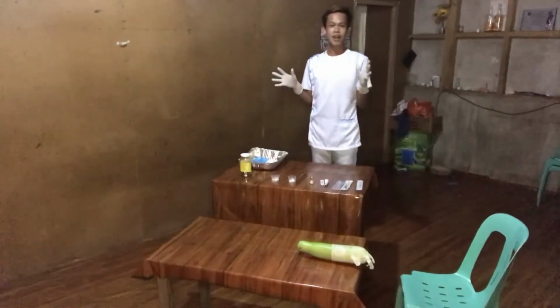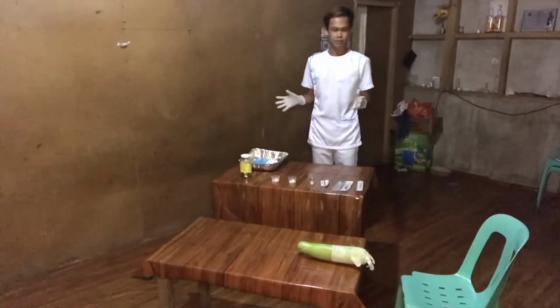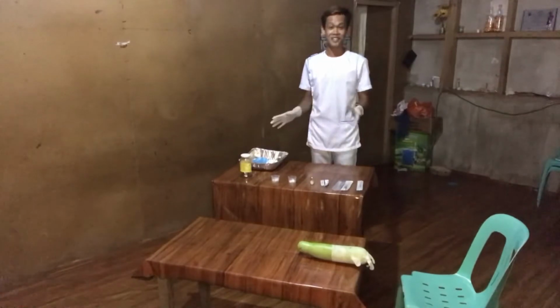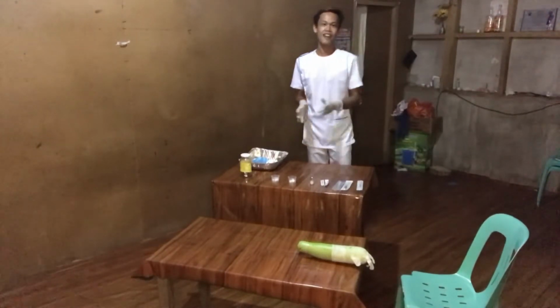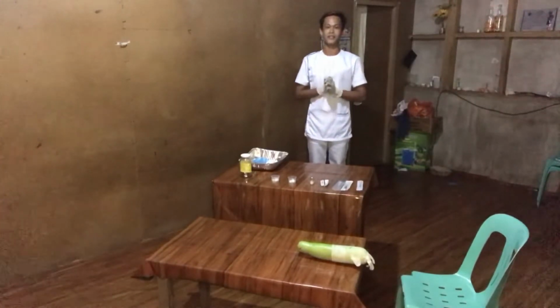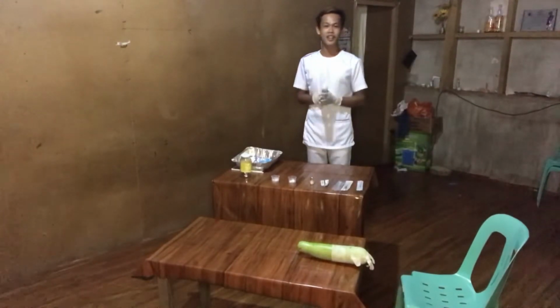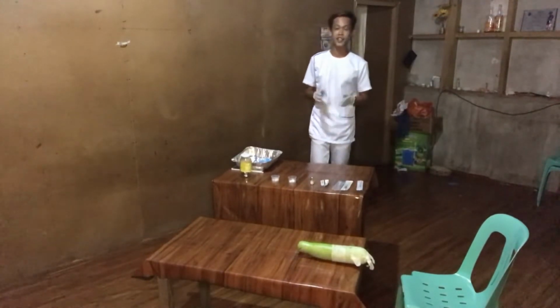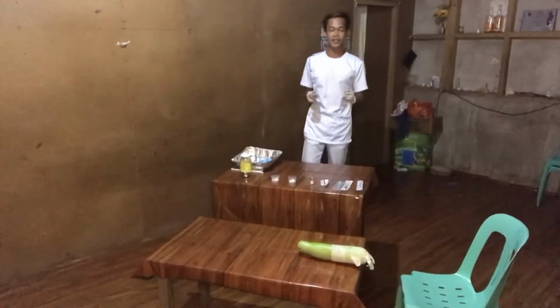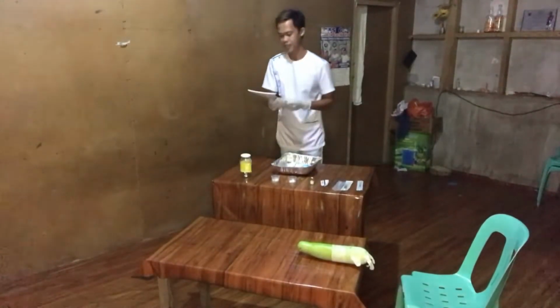Okay, all of the equipment is now prepared. Now check the doctor's orders on the patient medication administration record. This is done to identify what kind of drug is to be given. I have the medication tray, and I'm going to check this.